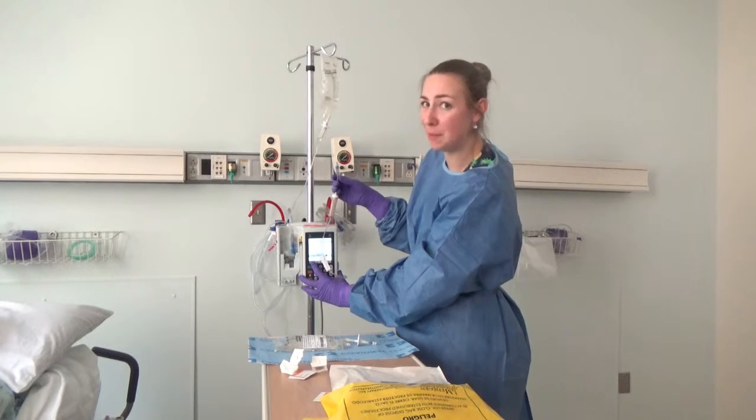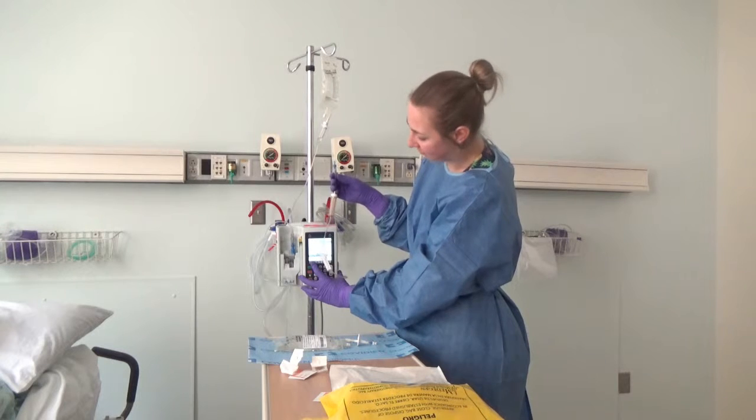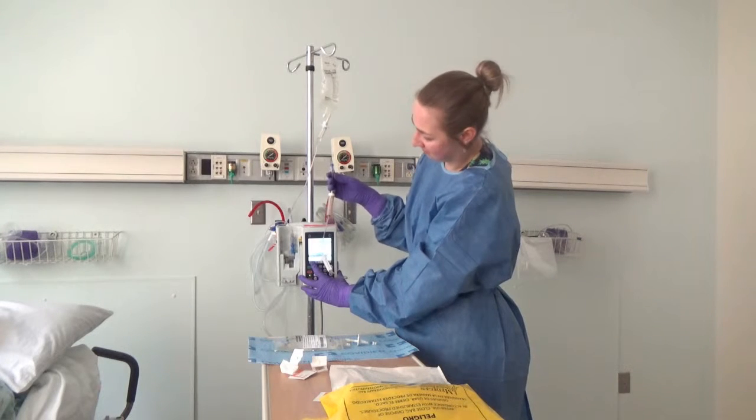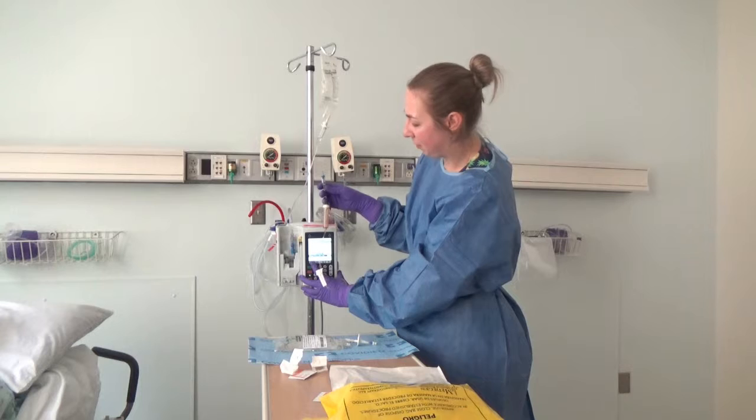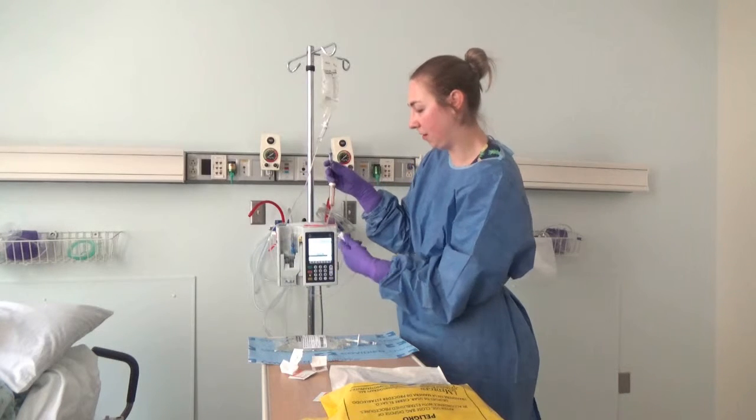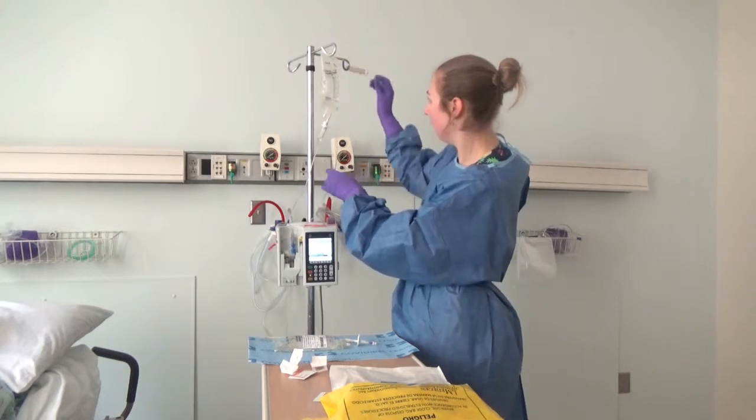Always make sure to check compatibilities with saline just in case. Now that I've back primed to the chamber, I'll clamp and hang my tubing out of the way.